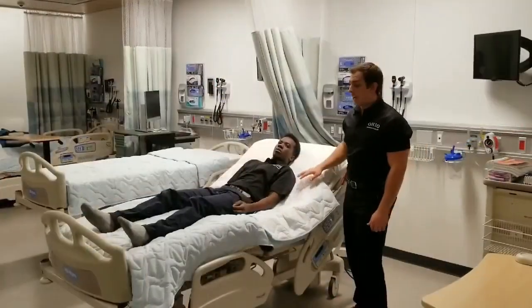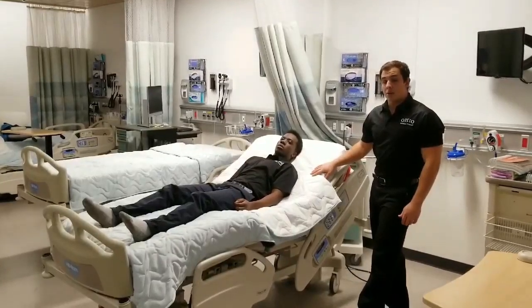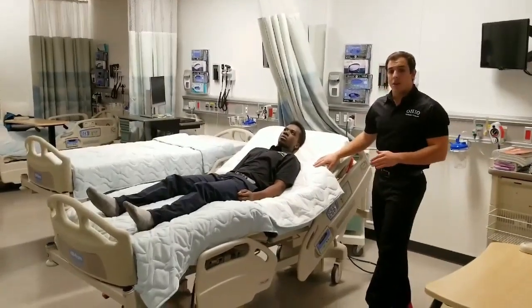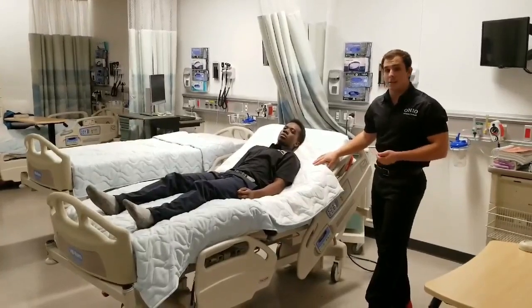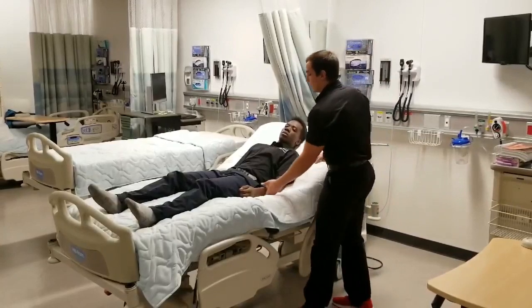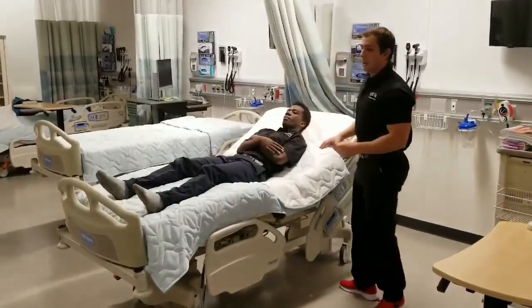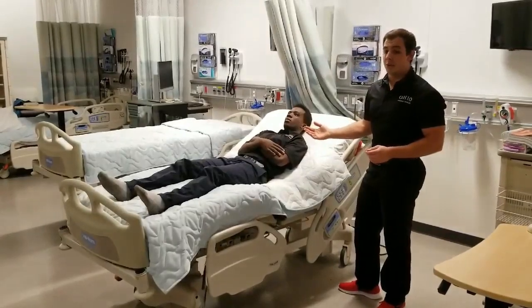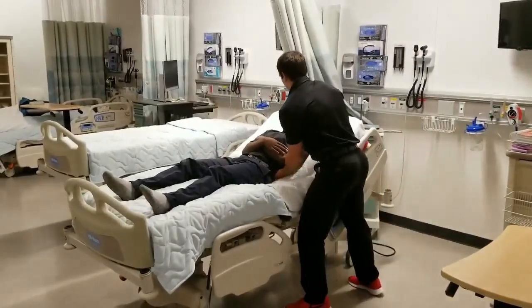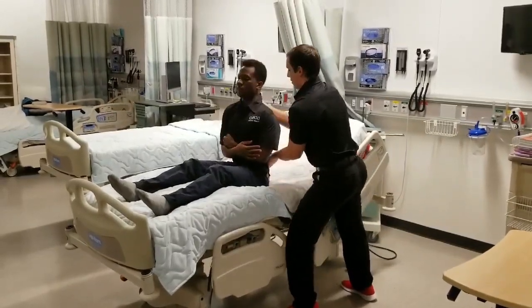This transfer with the hospital bed assist will make it a lot easier on you as a healthcare professional. So you'll do the exact same thing as you would with a regular supine to sit transfer. So what you'll do is just cross the patient's arms on their body. You place one hand behind the patient at the level of the shoulders and one at the low back. I'm going to lift you up in 3, 2, 1.